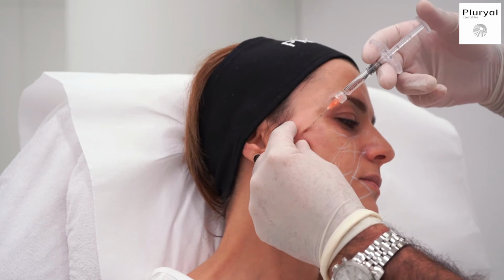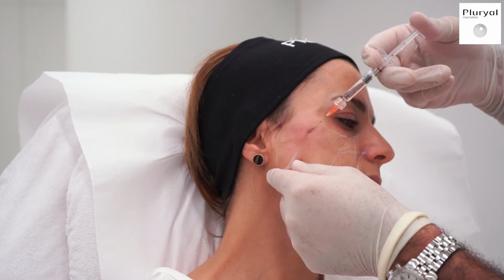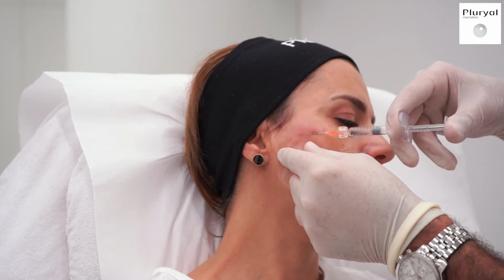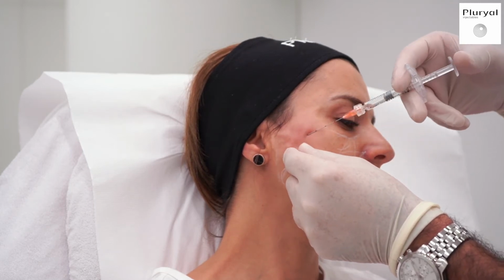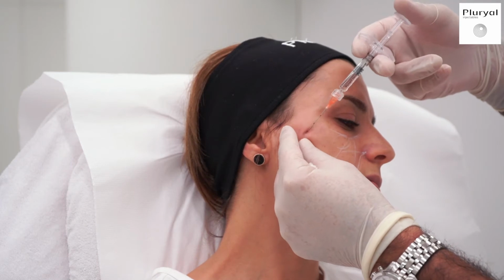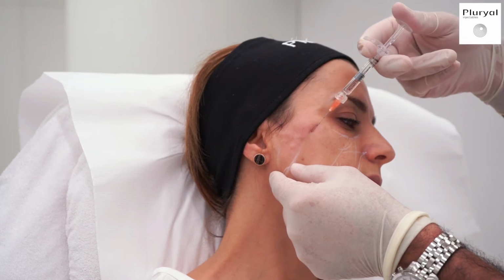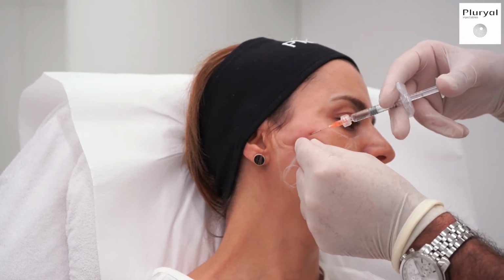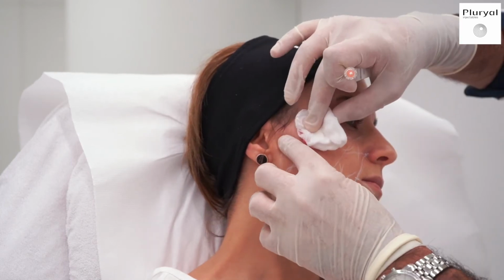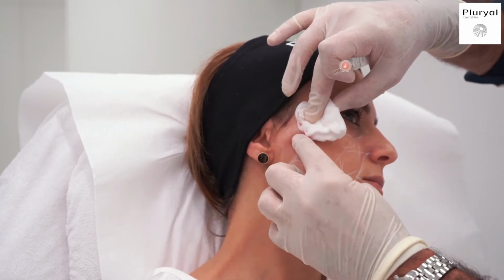So I fan it. I will also use 0.5 here. And then you spread it with massaging.